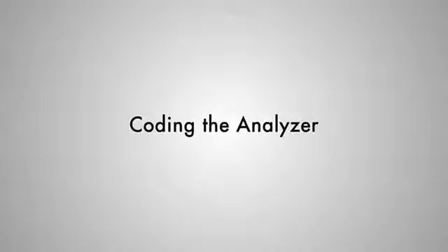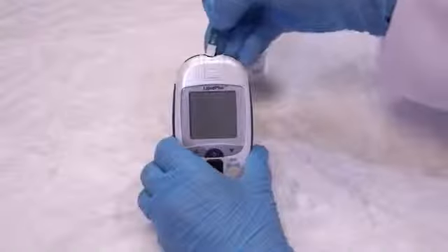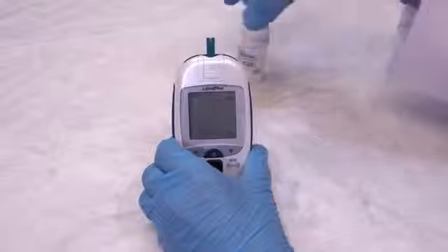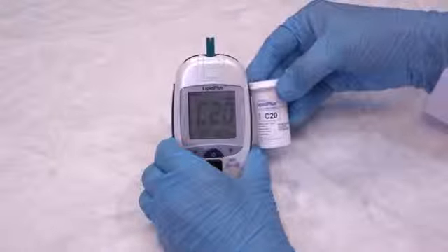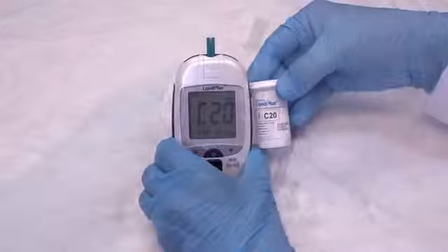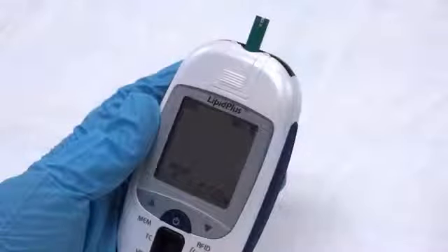Testing for glucose. Coding the analyzer. Firmly insert the glucose test strip into the test port of the LipidPlus analyzer. The power will automatically turn on, displaying the code number, temperature, date, and time on the analyzer. The code on the display must correspond to the code number on the test strip vial. The analyzer automatically reads the test strip code number from the color bar on the back of the glucose test strip.